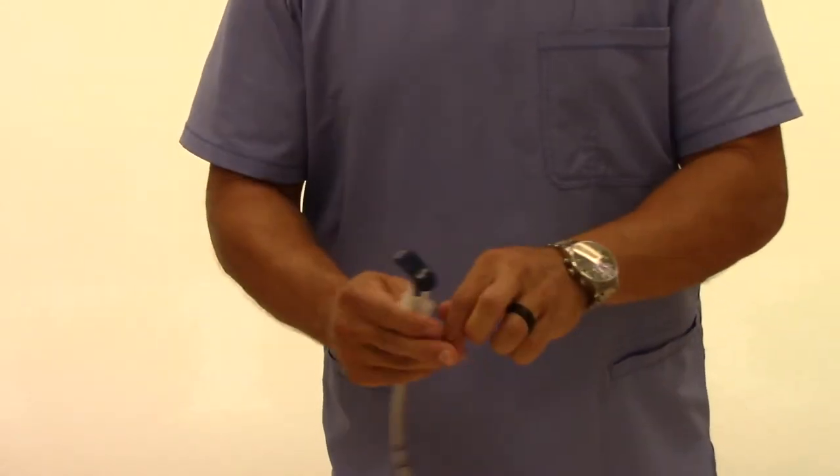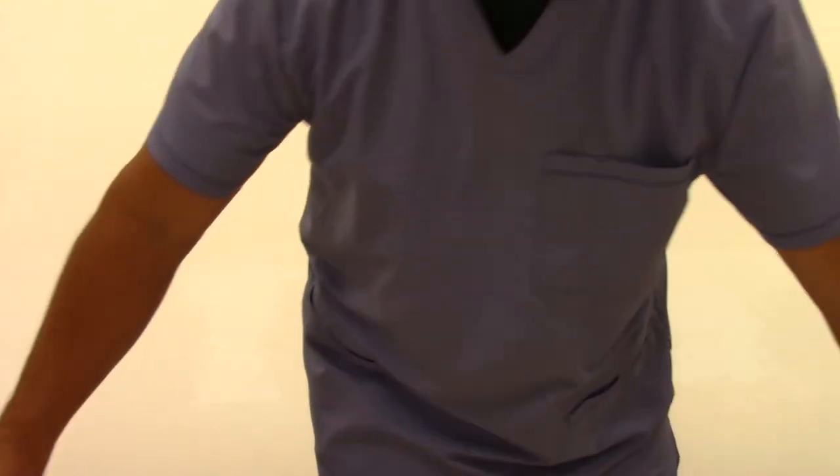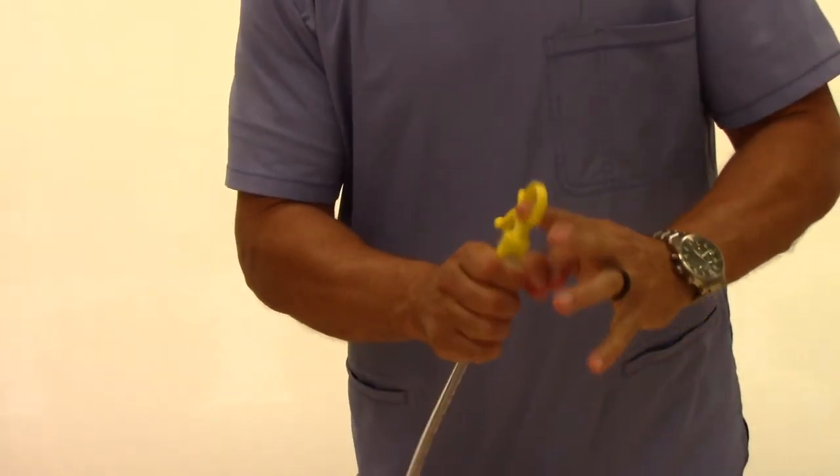Currently available stylettes are extremely difficult to remove from the endotracheal tube. Notice how easily the J-WAND pops from the distal connector using the thumb release.